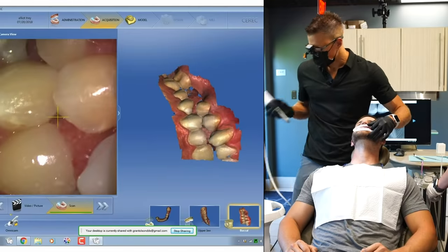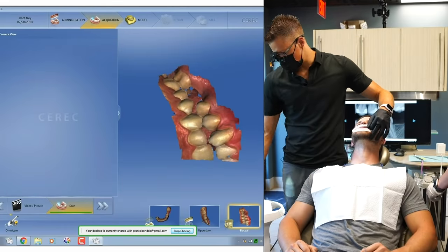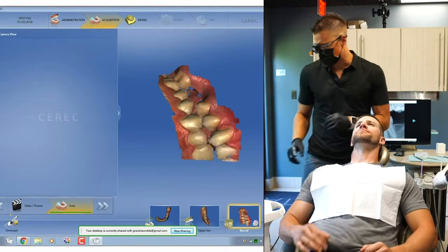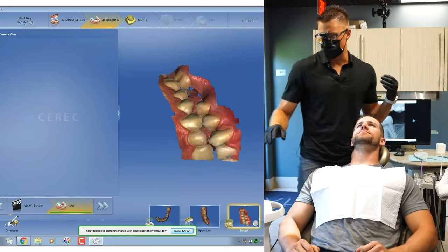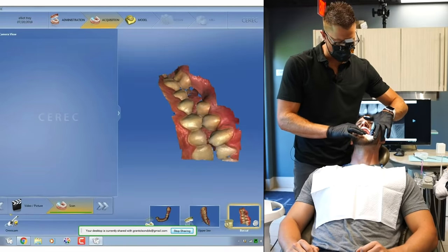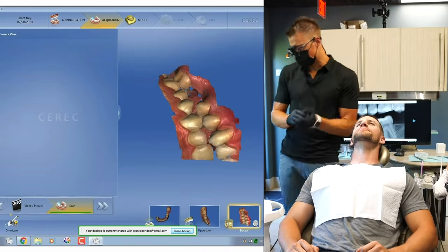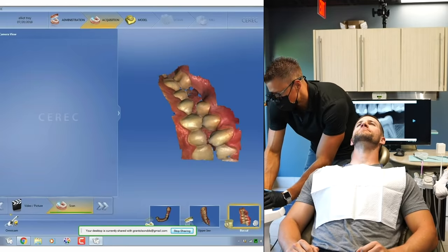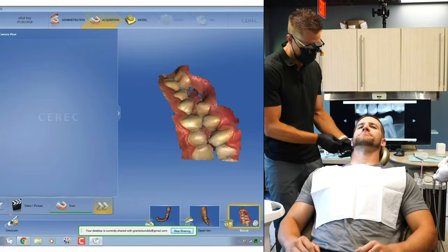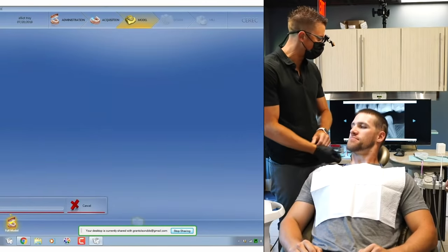So we've got a cross bite that if we didn't plan for, we're going to have a little trouble placing a nice implant. All right, and for those dentists or maybe some of the people watching that are students, I know there's a number of you, he would be a surgical class 3 cross bite. So there's not anything other than surgery to correct that. If you're going, well, maybe you should do braces first or something like that, that's not doable here without surgery. So, all right, you get to take a break for a little bit here. Actually, we will take a 3D x-ray in just a minute.